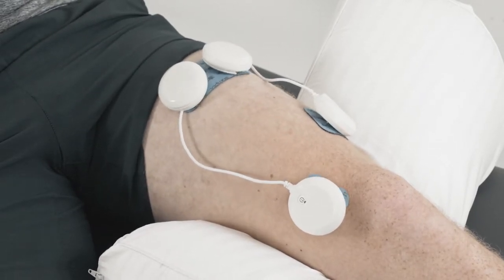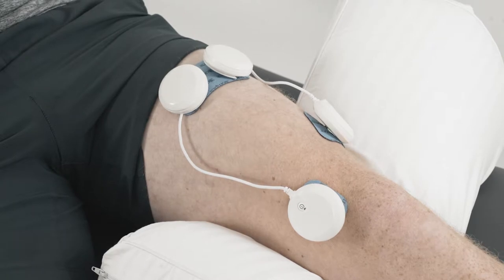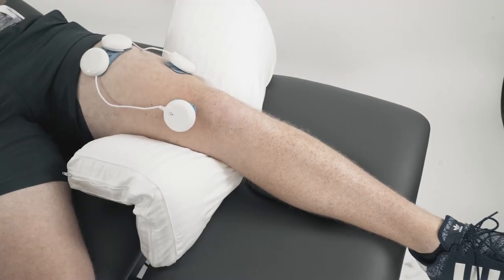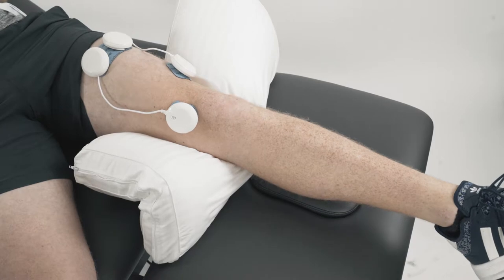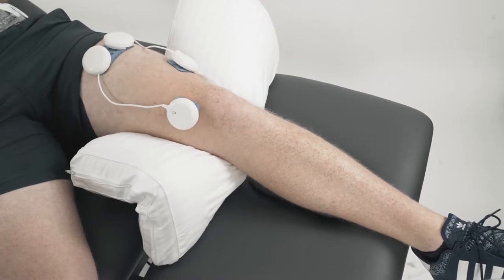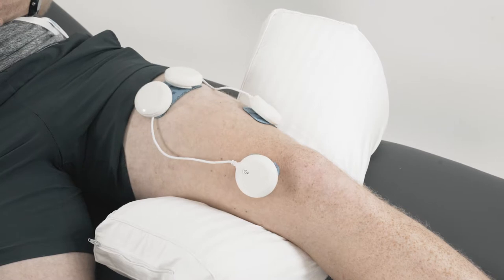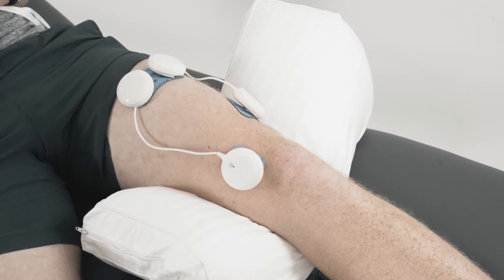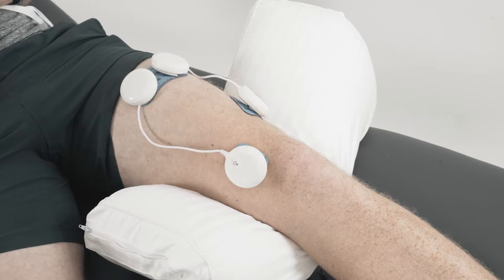With the program, we're using the disuse atrophy program. We'll get a nice contraction through VMO, which is really going to be important following any sort of operation or injury. What we ask the patient to do during the active phase of the treatment program is to voluntarily contract their quadriceps muscle and hold it for the duration of the active component. As you can see, a really nice muscle contraction throughout. Then we're going through into a relaxation phase, which will then go back to another active contraction phase, and again you see a really nice contraction through VMO and the rest of the quadriceps muscle.